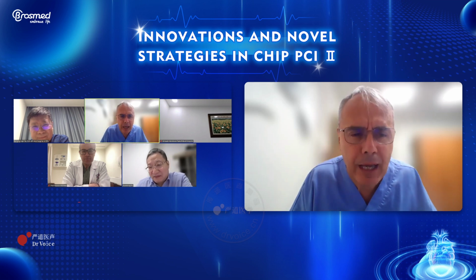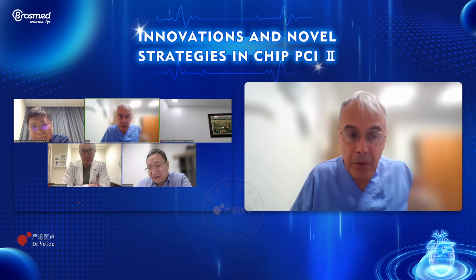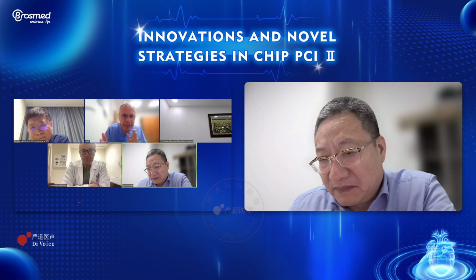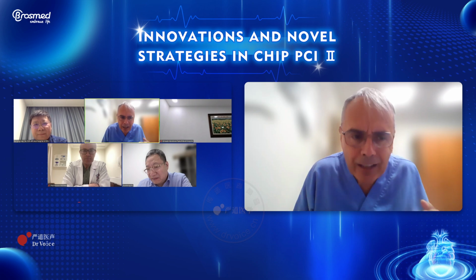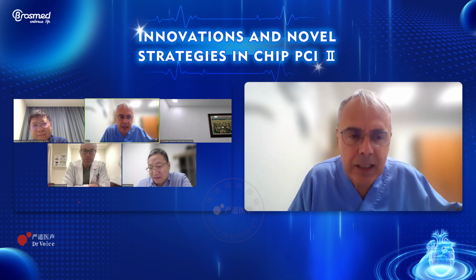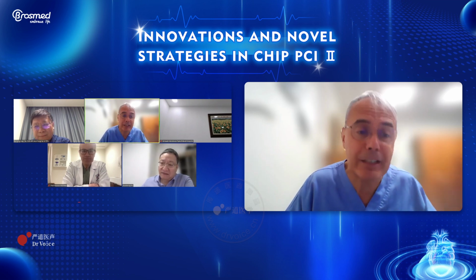Okay, thank you for the question. Two rapid answers. First of all, I believe a lot in DCB in de novo lesion, but especially in vessel less than 3.2, the result is very, very good. Now we wait the TCT data from the larger vessel.